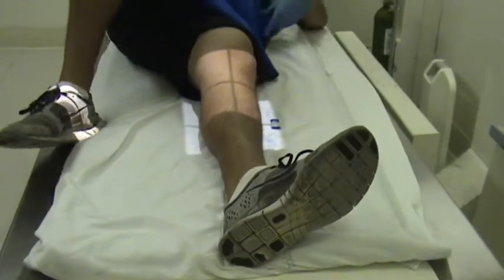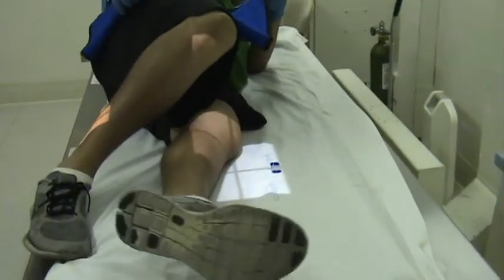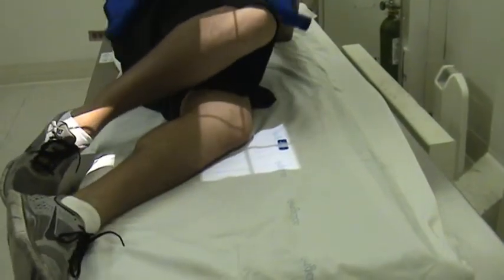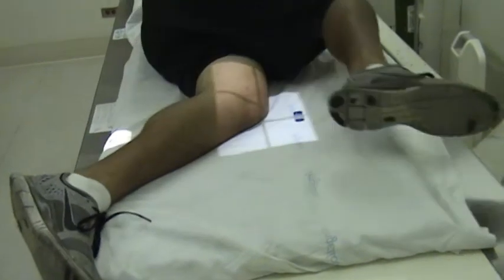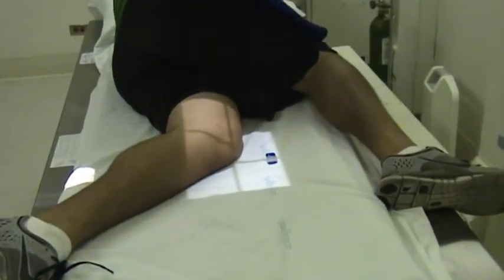For our next shot, it requires our patient to lay on the affected side with their knee bent at a 30-degree angle. This is known as a lateral projection or medial lateral shot. We want our center ray to enter at the level of the epicondyles or the condyles of the femur.